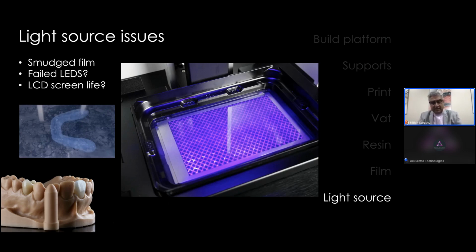I've not heard of anybody having a light source issue with the LEDs in the Sol just yet, but it is potentially something else that could go wrong. So you could have failed LEDs, you could have a failed LCD, and I haven't heard of either of these with any Sol user that I'm aware of.